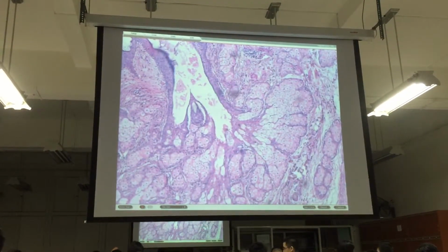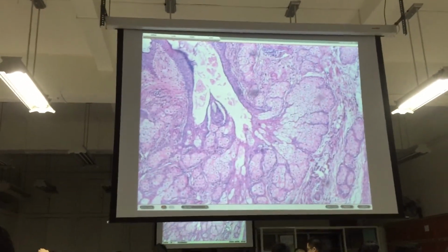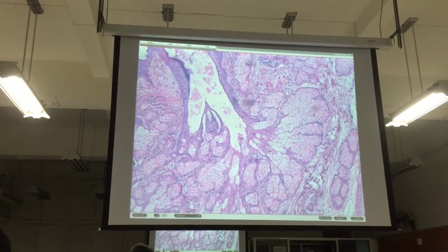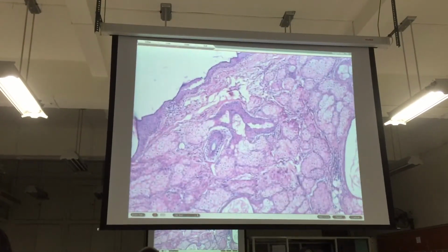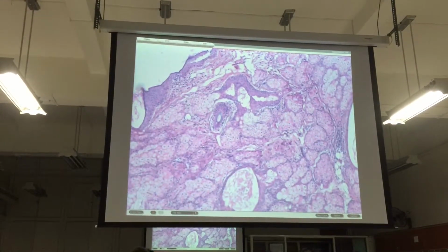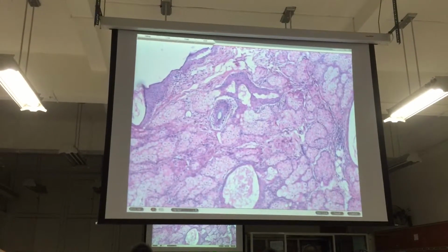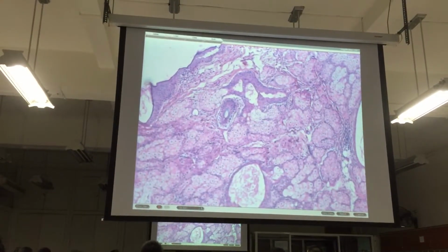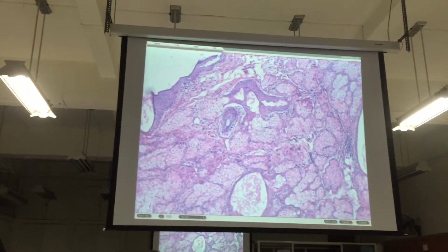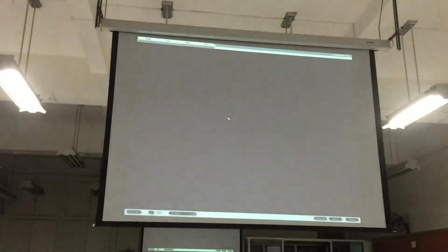Sebaceous glands. Okay? So, because of this, these sebaceous glands continue to secrete sebum or sebaceous material in the cyst. Okay? And you have skin adnexa. Sometimes, okay, you see this one is a hair follicle. You will see hair. Okay. What is your diagnosis? Teratoma. Okay, but only in mature cystic teratoma, you don't only see skin tissues like this one. You will also see different tissues from different germ cell layers.